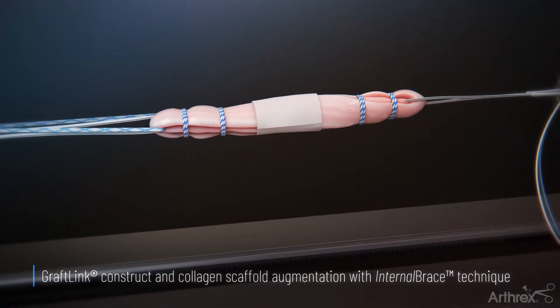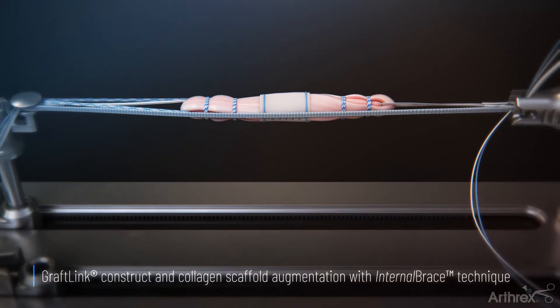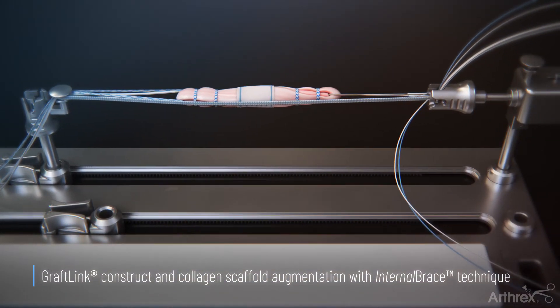The graft construct is then wrapped with a collagen matrix, and the Arthrix internal brace technique is used to augment the graft construct.